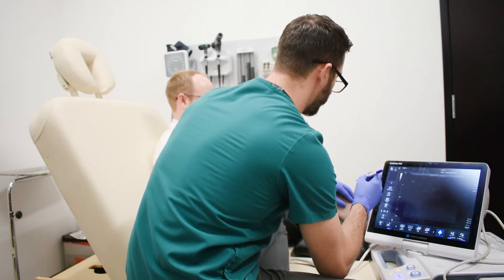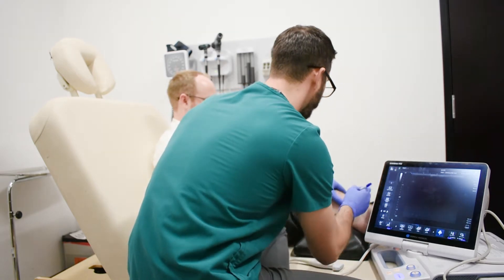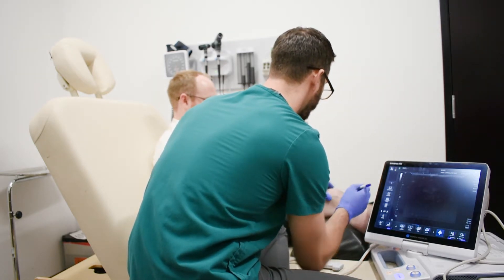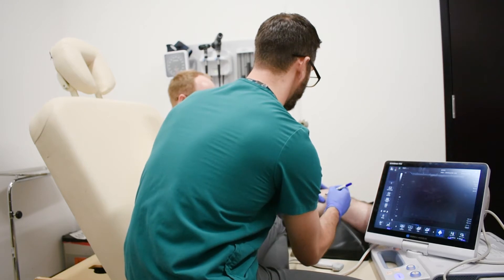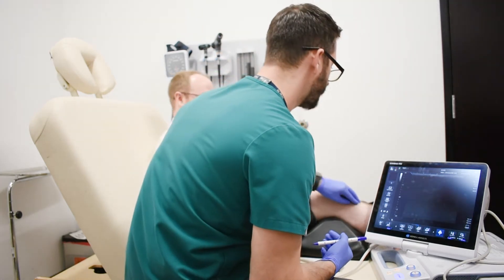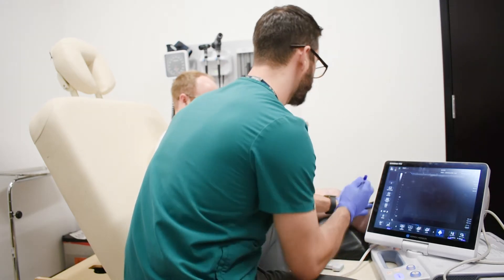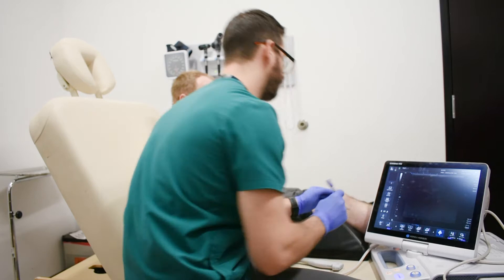Patellar ligament down to our tibial tuberosity. These are the basic landmarks that you're going to use, and you can palpate the distal end of tibial tuberosity.